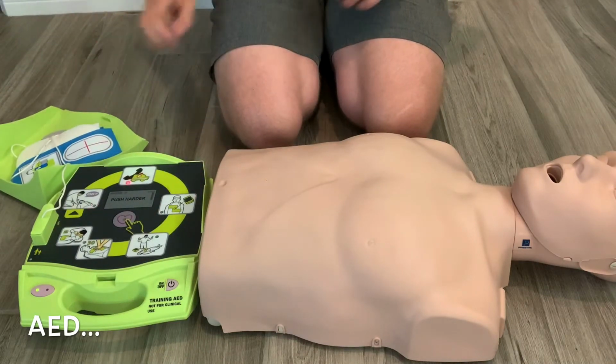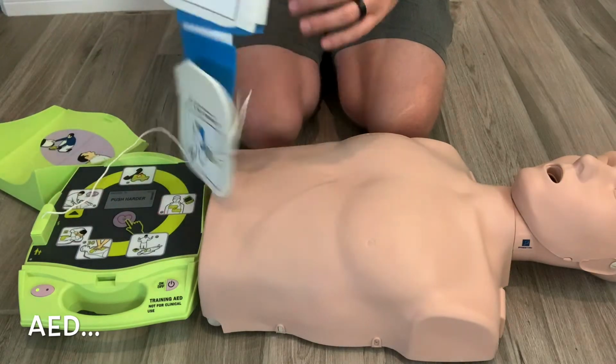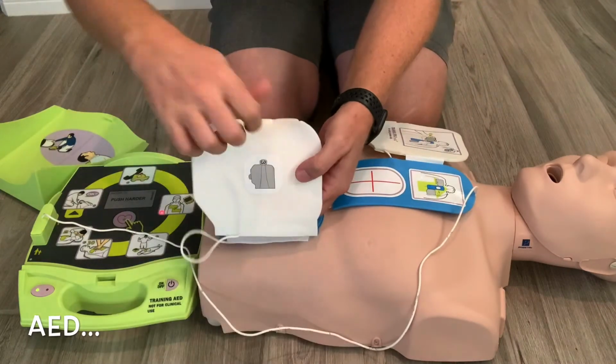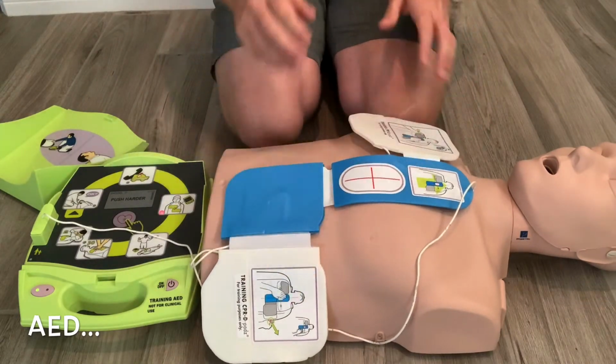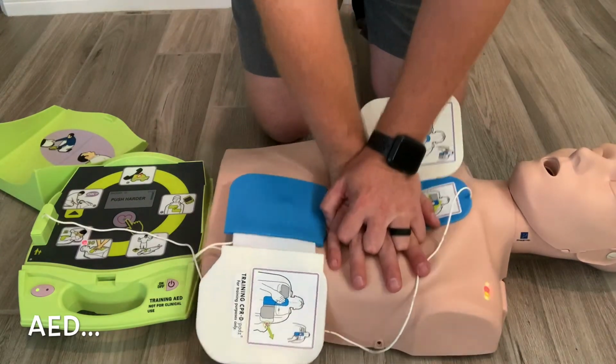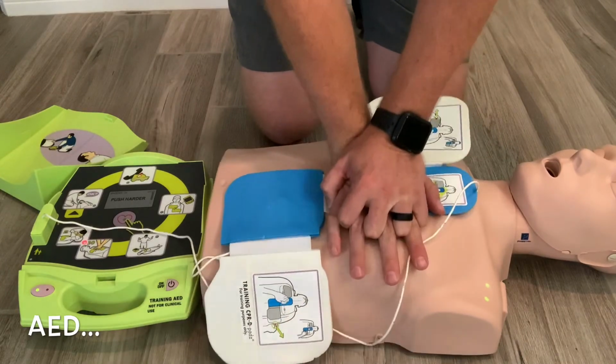Unit OK. Stay calm. Check responsiveness. Call for help. Attach defib pads to patient's bare chest. Don't touch patient. Analyzing. Shock advised. Don't touch patient. Press flashing shock button. Shock delivered. Start CPR. Push harder. Good compressions.